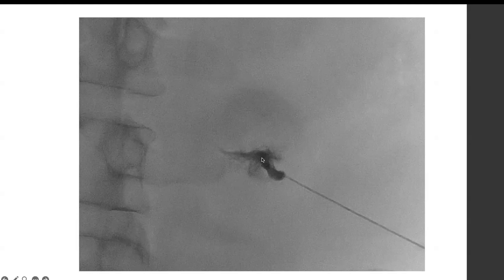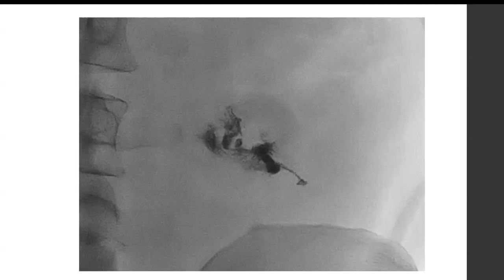But we're injecting contrast into the dominant vein, and then you want to close the varix. And the hope is that this is the actual vessel that's bleeding. So you inject typically glue. So this is glue here. It looks just like contrast, but it's closing the varices that hopefully are bleeding.